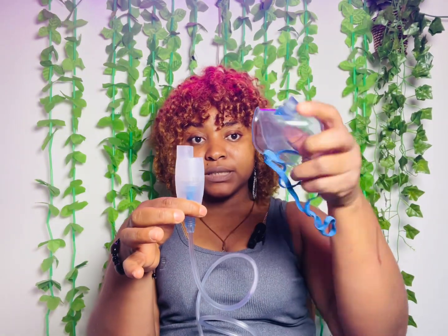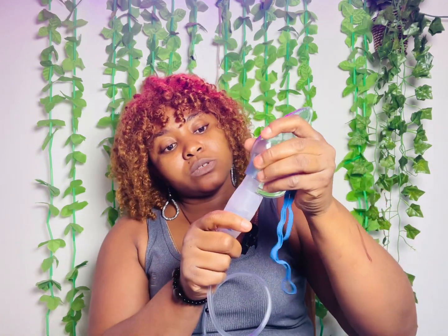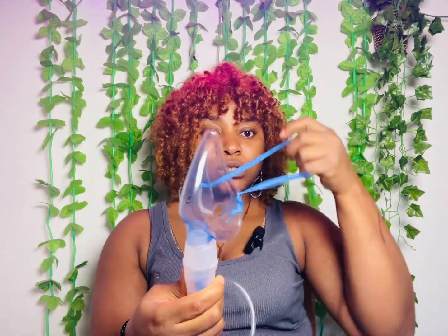We are going to take one of these. This is the adult nose mask. We have that for kids as well, so this machine is for kids and adults. You're going to take this nose mask for adults and put it like so. And voila, that's it. You're going to wear it.